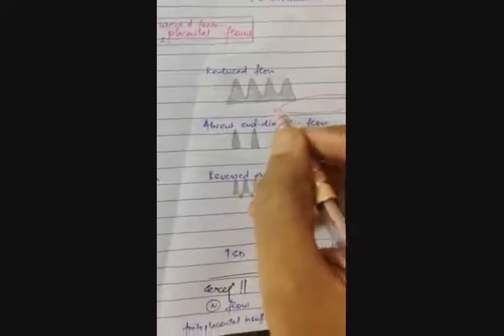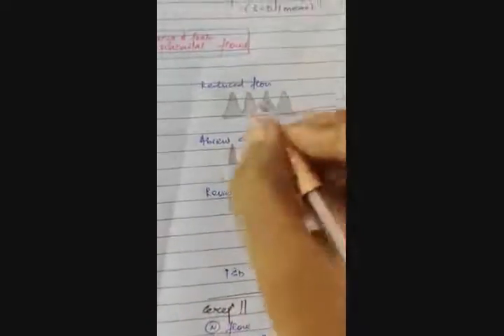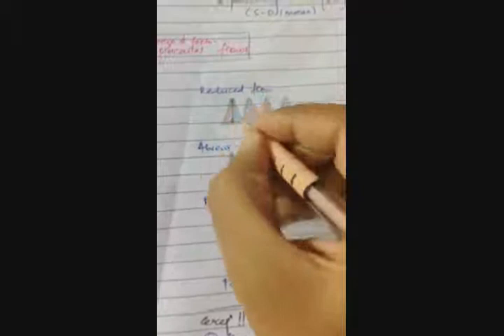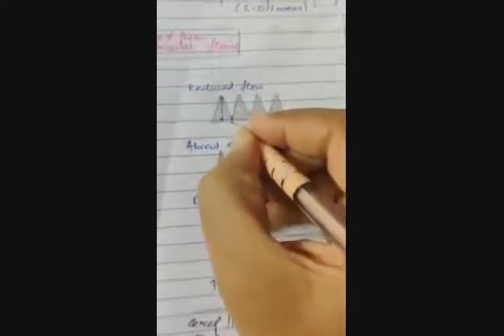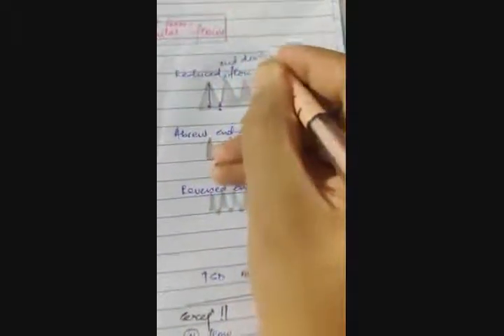Back to the umbilical artery. What happens if fetoplacental flow is compromised? Three things can happen, alright. One is the diastolic flow decreasing, reduced end diastolic flow. What do you do here? You keep the patient on follow-up.